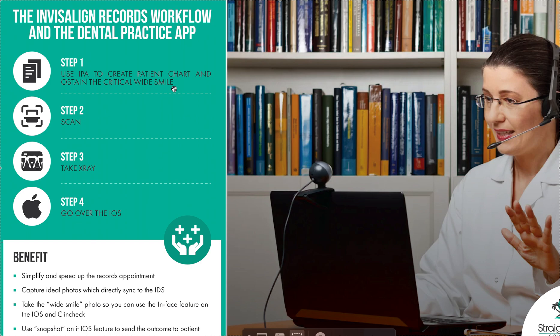The main thing you want to do with the critical wide smile is make sure it's a big, cheesy smile. There's a lot you can get from a natural smile, but the critical wide smile is the only photo where we want to make sure the patient's chief complaint is reflected in it — so that when we do the outcome simulation and the In-Face feature, they can see that the chief complaint has been addressed. For example, if the chief complaint is the gap between teeth 8 and 9, that's usually going to show up in a smile. But if it's a narrow smile, we want to make sure the smile is big enough that we can see those buccal corridors. If the chief complaint is lower incisor crowding, we want to make sure they're also showing their lower front teeth when smiling, which is a little different than a normal smile. So there's a special type of smile photo you want to take so it reflects well in both the Outcome Simulator and later in the ClinCheck.